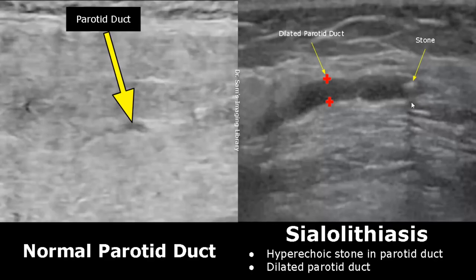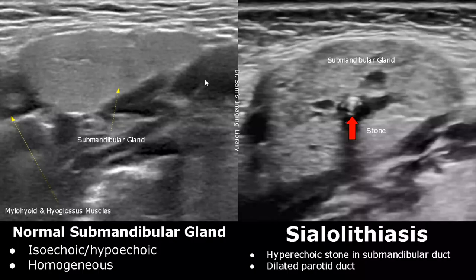Stones are a common cause of dilated parotid ducts. Here is a case of a stone within a submandibular gland duct. We can see the hyperechoic stone with posterior acoustic shadowing.